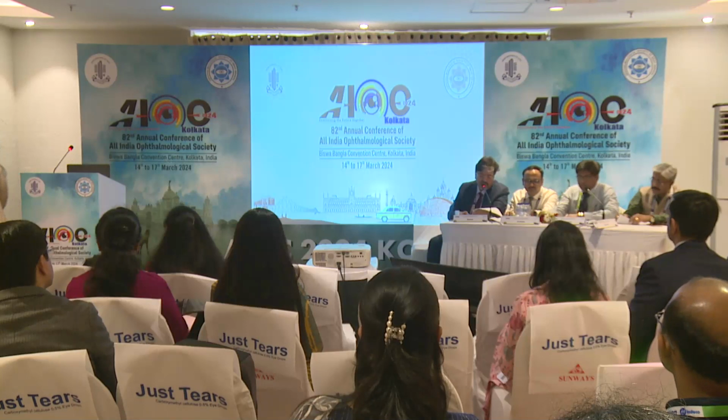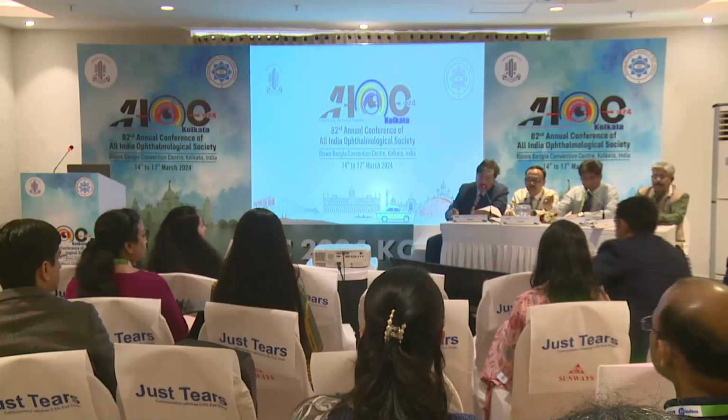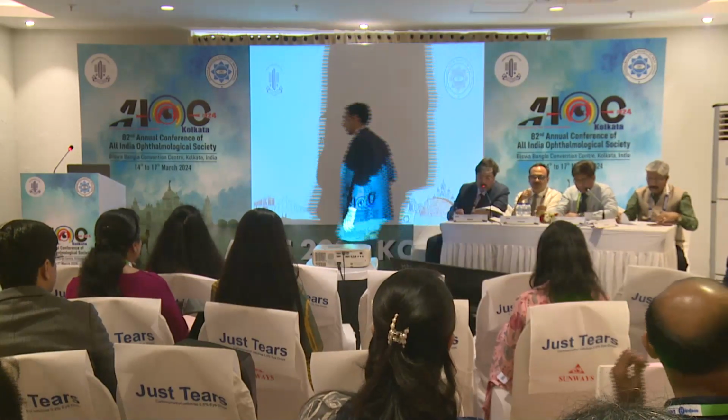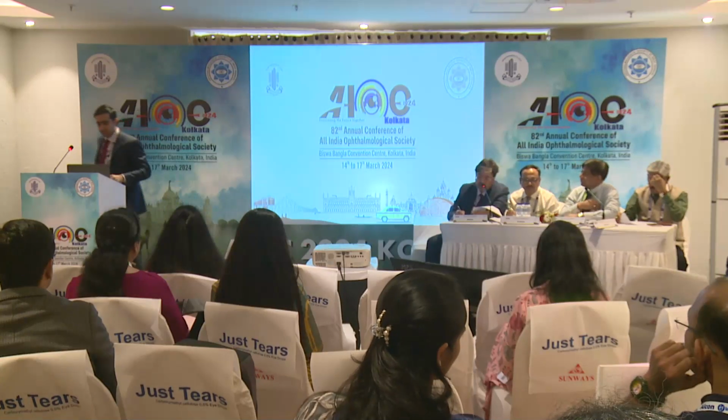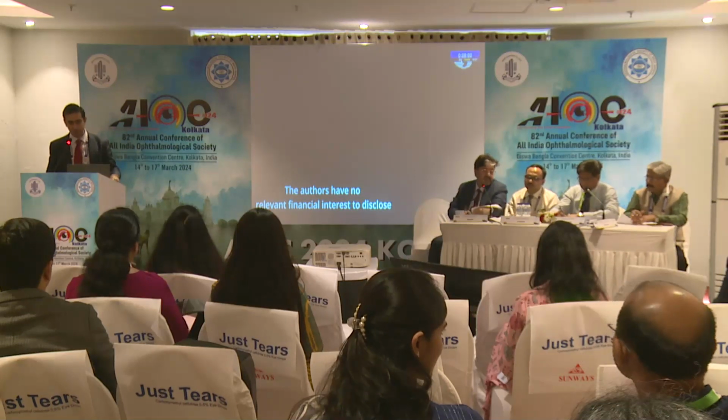So next we'll call upon Dr. Rushabh Shroff, Bubble Trouble, doing DSEK in difficult situations. Can I have the volume also, please?